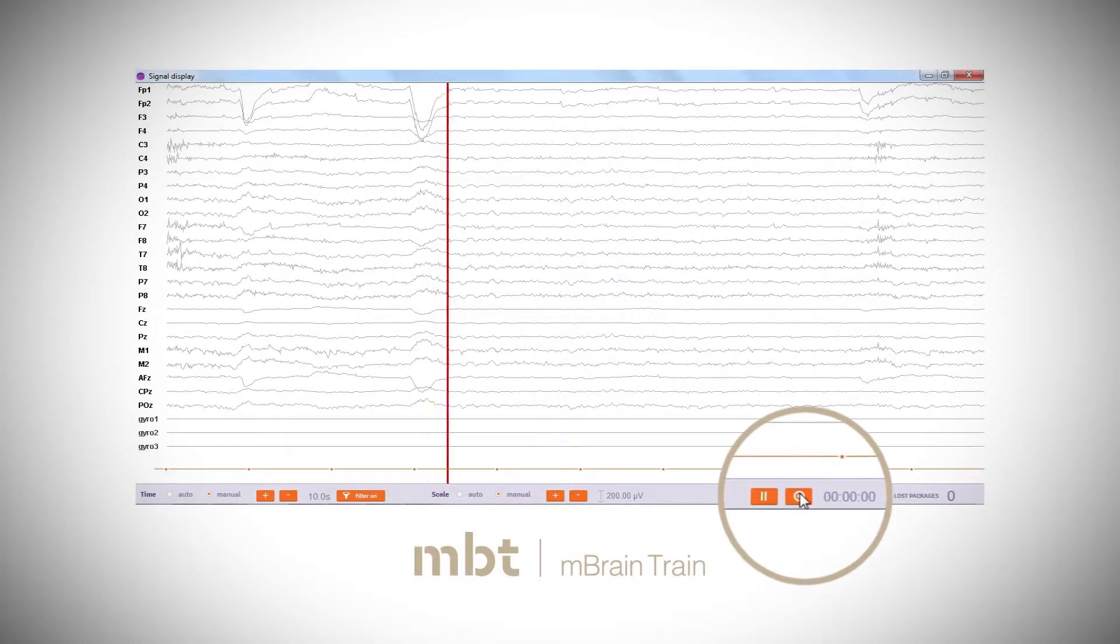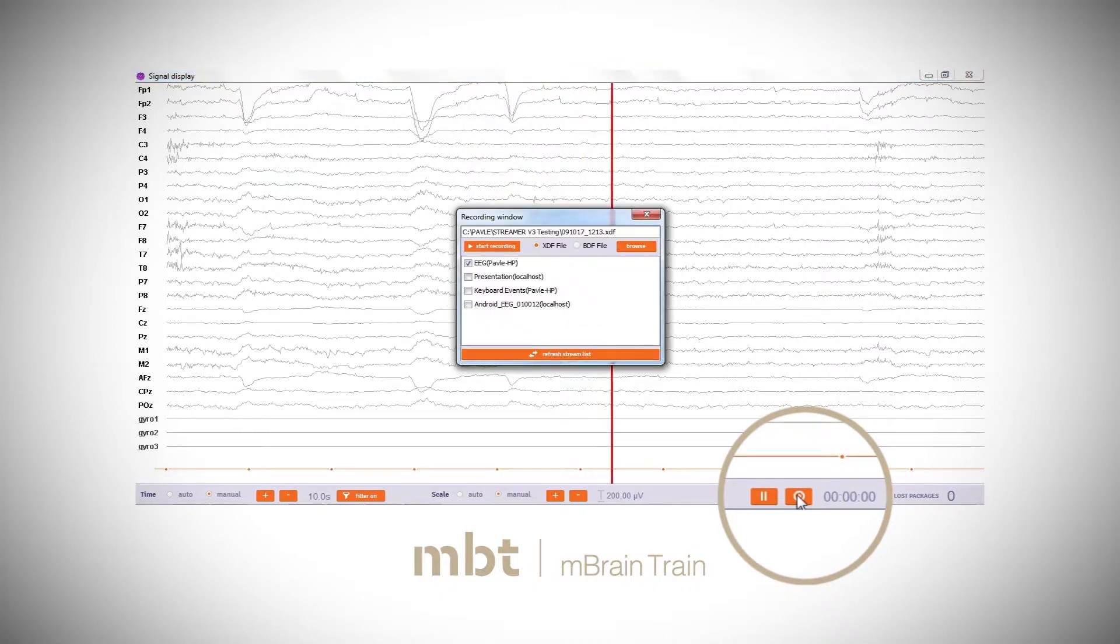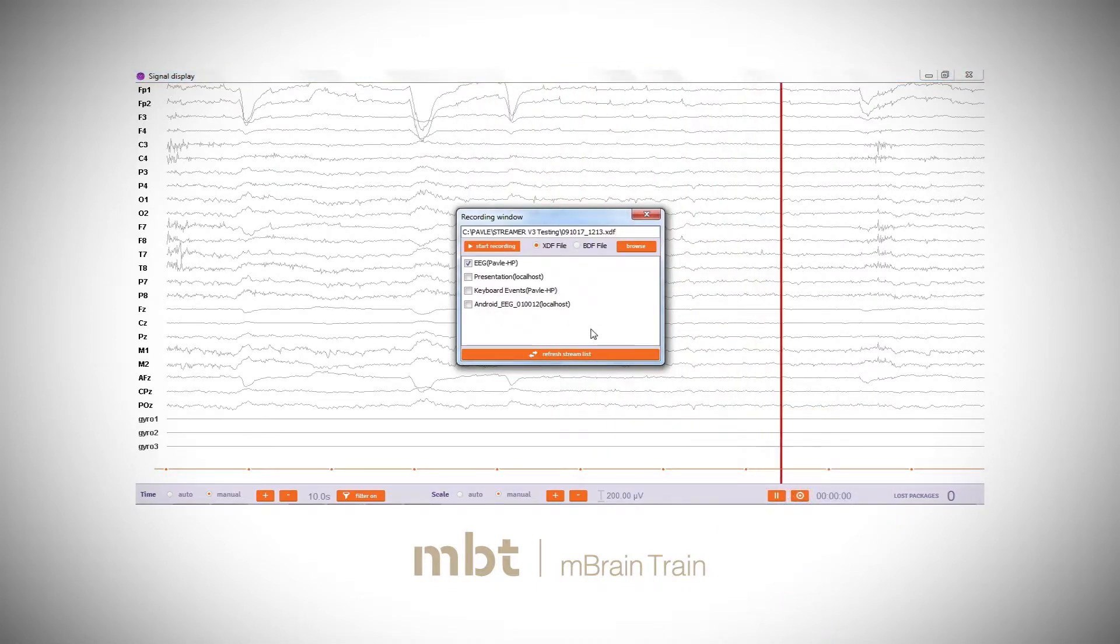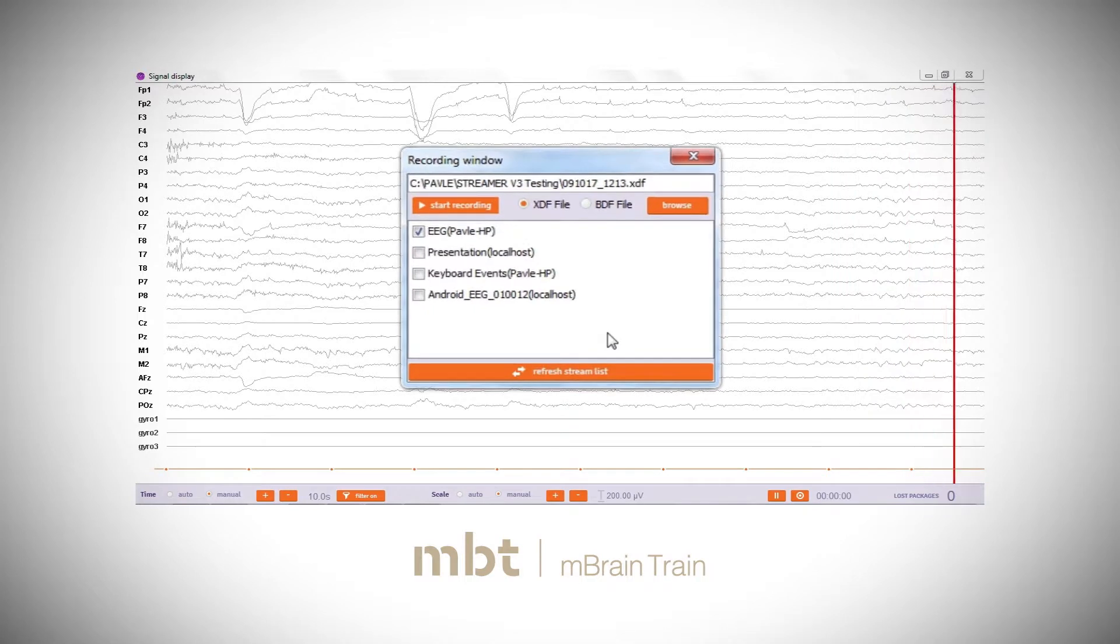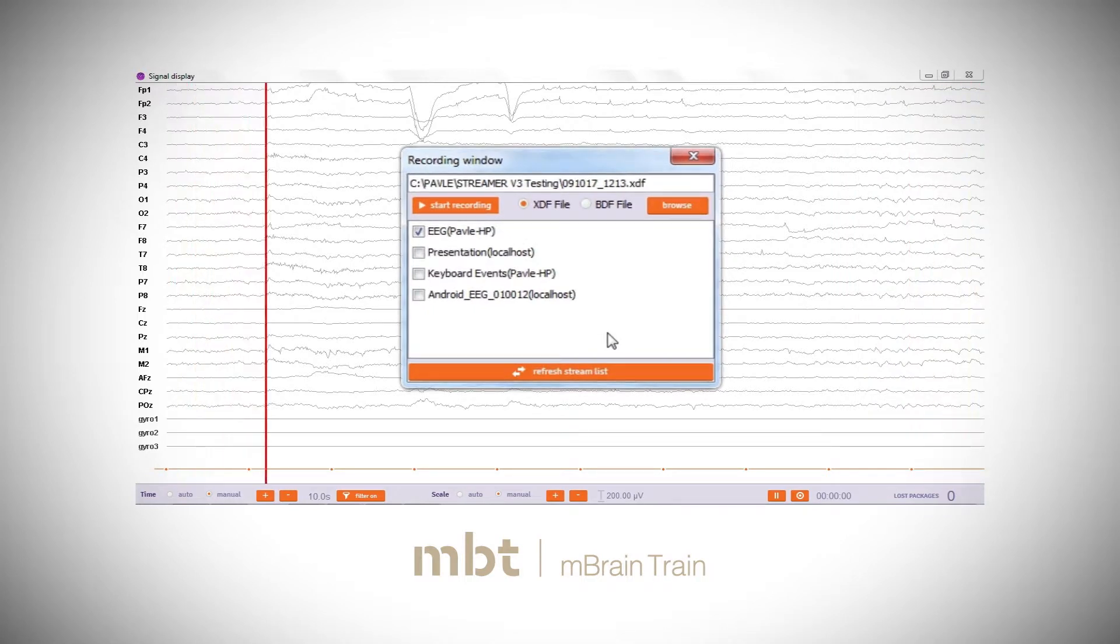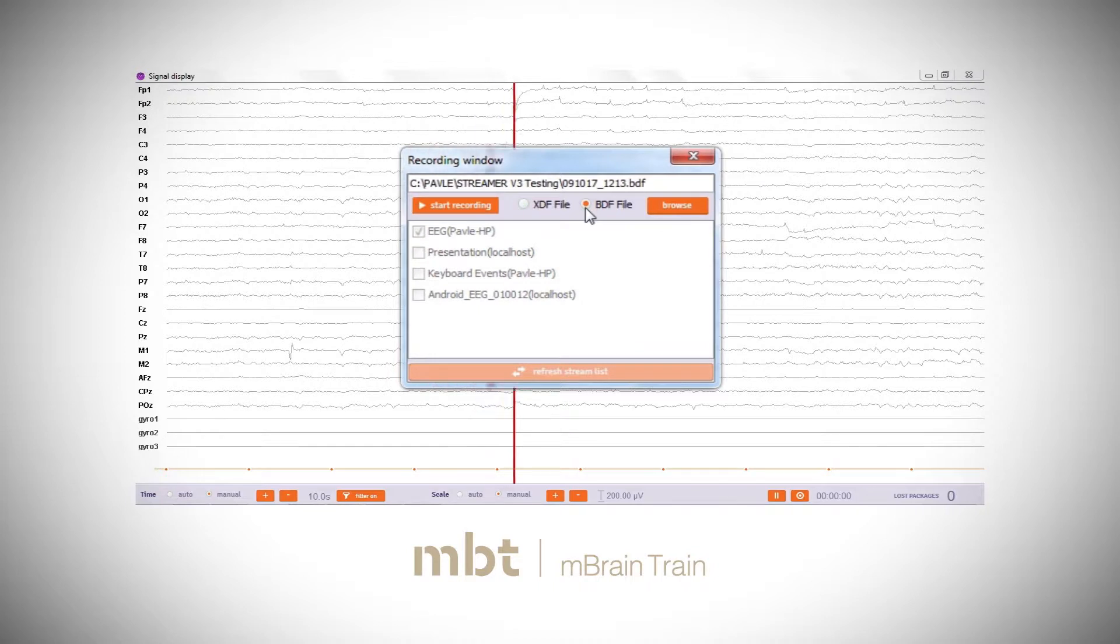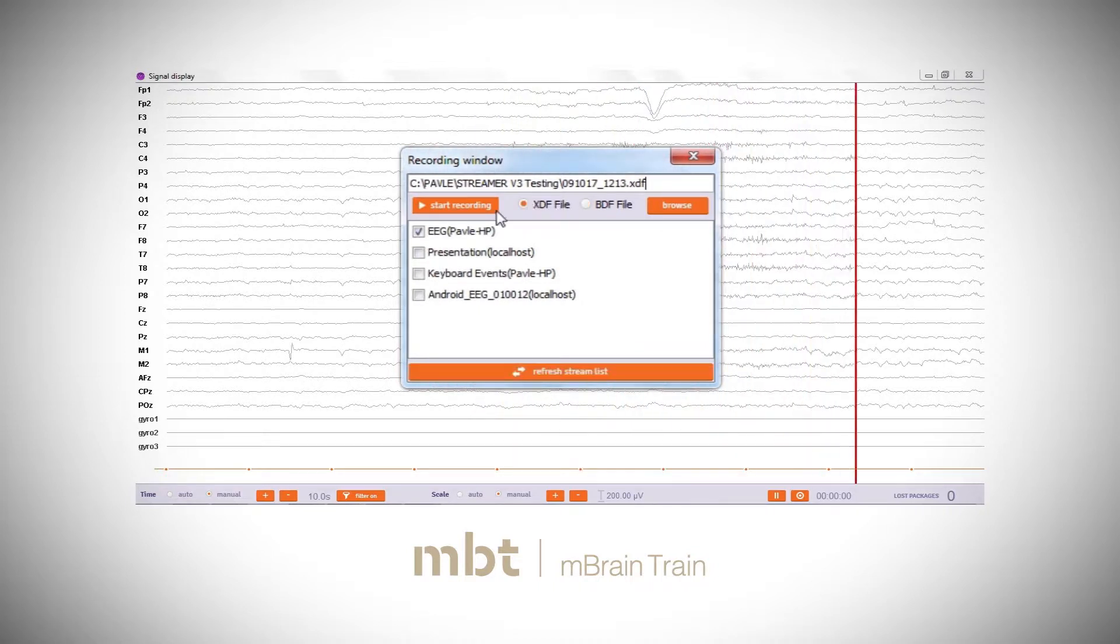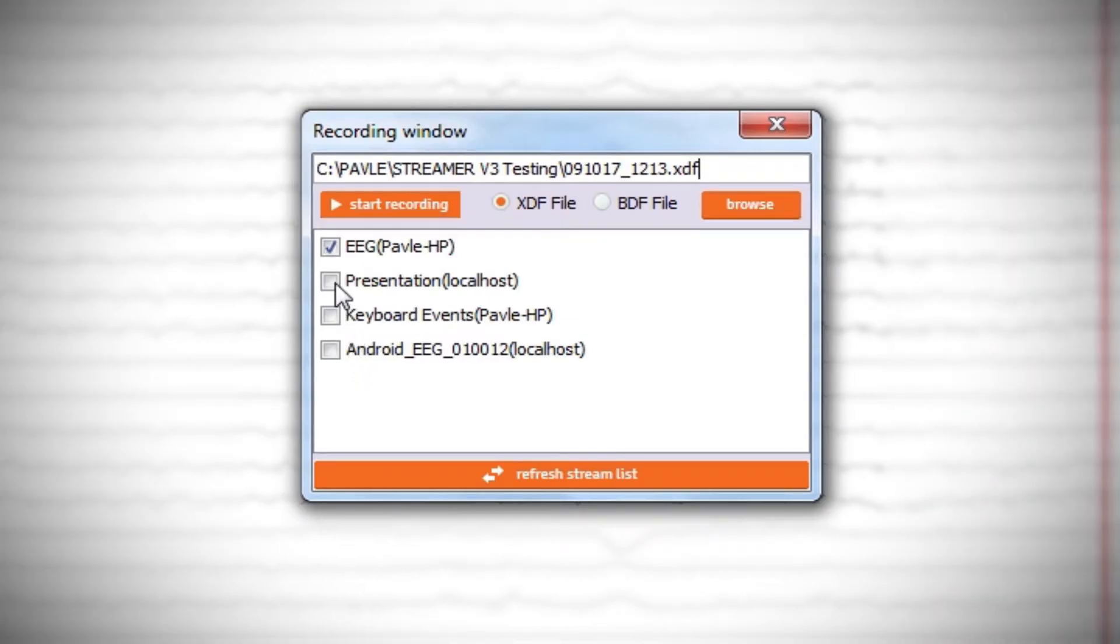Click the record button in Smarting Streamer's signal display window. For a presentation experiment, select the XDF file format. If sending event codes over UDP protocol, select the BDF format. Click the boxes of the streams you want to record, in this case EEG and presentation.